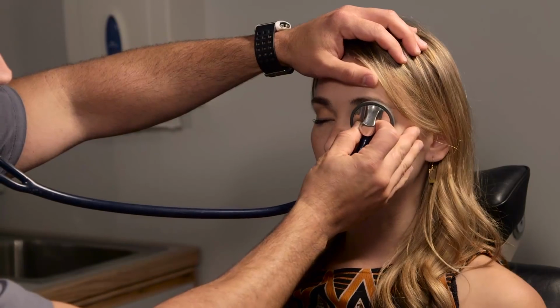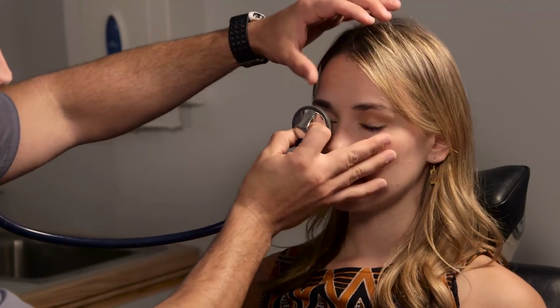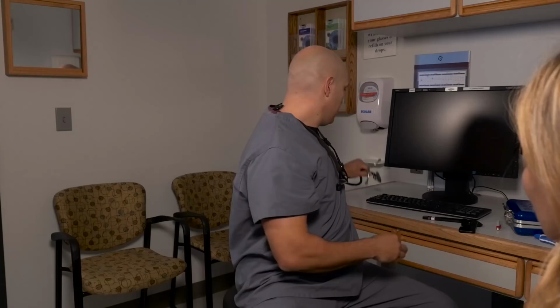Right. So with the stethoscope, you're actually going to put the stethoscope over a closed eyelid and then listen. And if you hear a bruit, it's a very concerning finding and you want to get imaging as soon as possible, okay? Can gently close your eyes for me. Perfect. Good. Very good. Okay, no bruits.